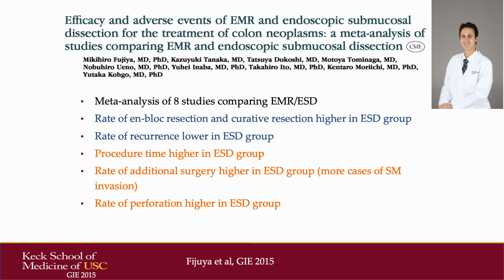There has been a large meta-analysis of 8 studies that compared ESD to EMR in the colon. What they found was that in the ESD group, there was a much higher rate of en bloc resection, and the rate of recurrence was also, as expected, lower in the ESD group. However, the drawbacks of ESD were that the procedure time was higher.